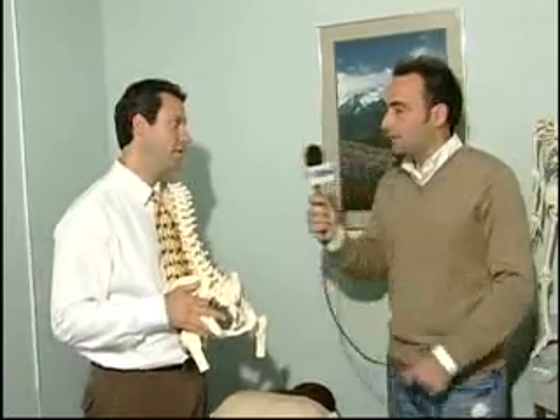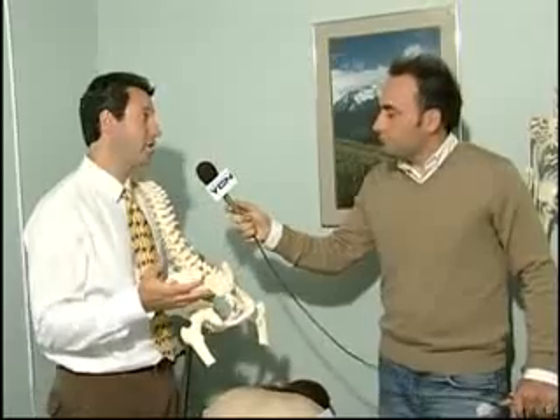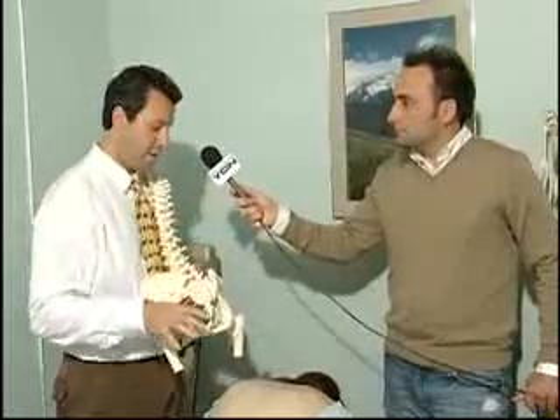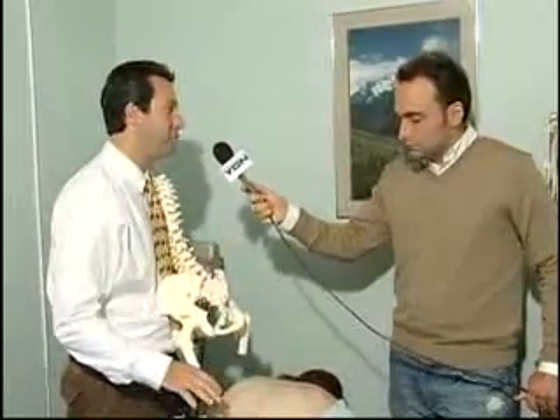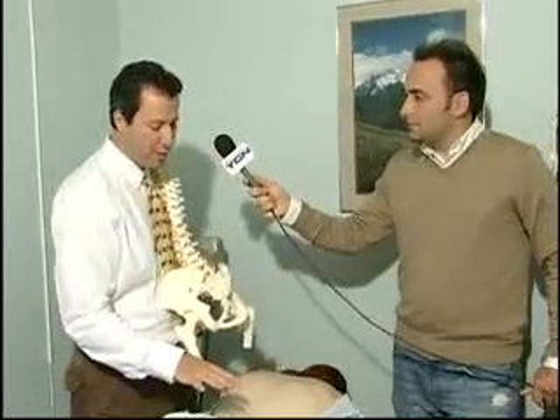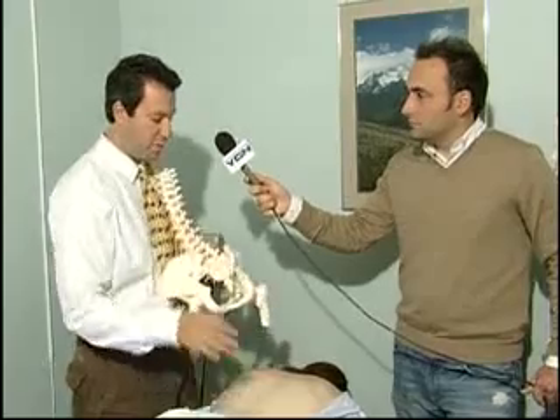What are we going to see today? This is called the Advanced Spinal Mobilization Instrument. Really, it's a unit to help with relieving back pain. The theory behind it is that people have sprains and strains from automobiles, a lot of injuries, a lot of disc issues. We've talked about those in the past. But this works in a specific way.